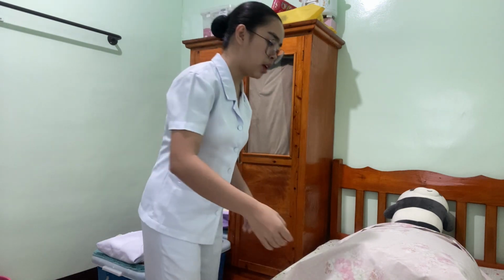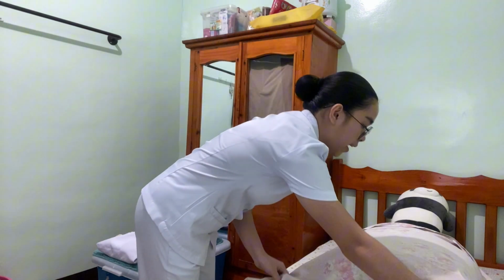Okay. Now, I will drape the patient, exposing only the area to be used. So this is done to avoid the patient from getting embarrassed and having chills, which causes tension and which may interfere with the easy insertion of the catheter. So, ma'am, I will expose your genital area.